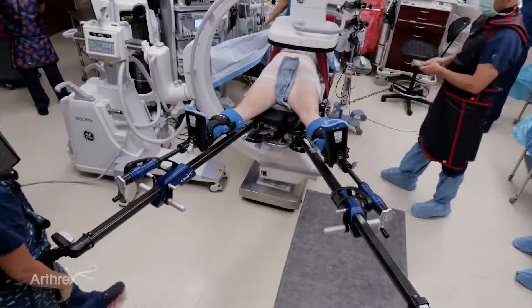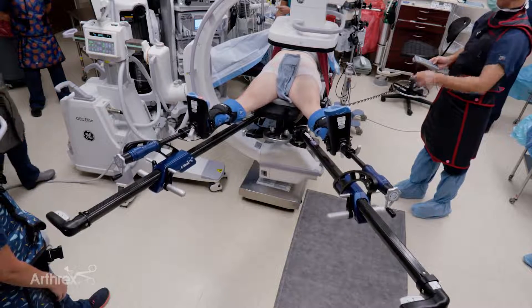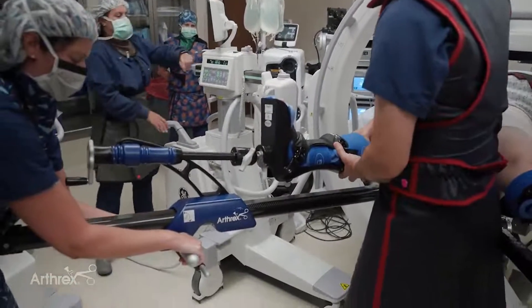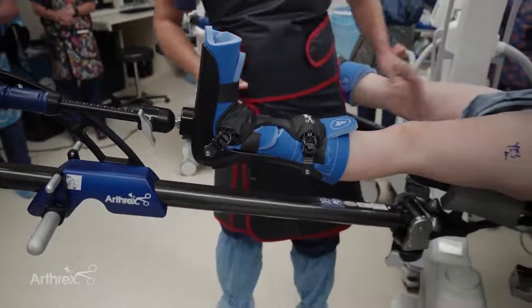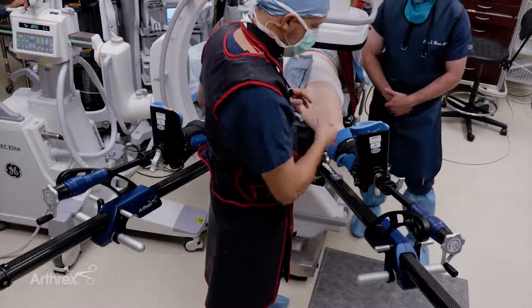Now we'll apply the traction. We'll place the bed into a bit of Trendelenburg, making sure we're locked down here, about 15 to 20 degrees. We put a little bit of gentle traction on the contralateral hip to give it some stability. I use a three-person technique: one person giving some gentle compression to the pelvis, primarily on the contralateral side, which tends to prevent the pelvis from rotating.